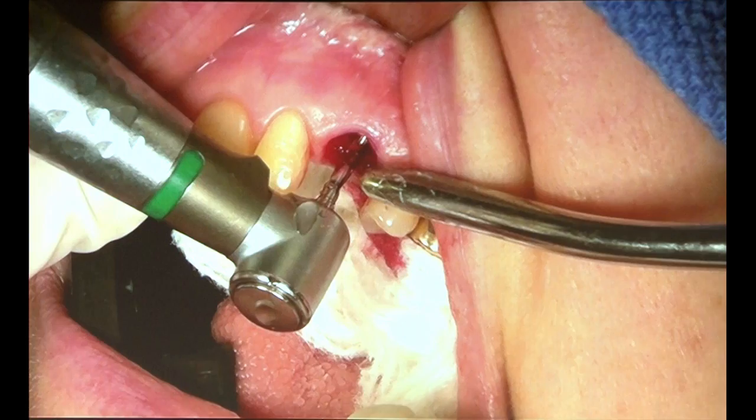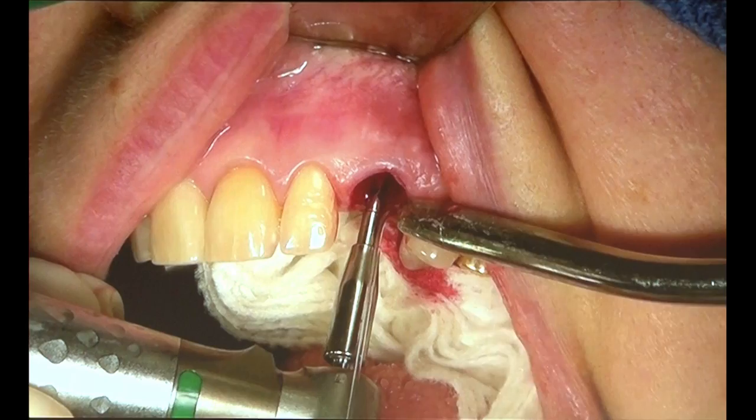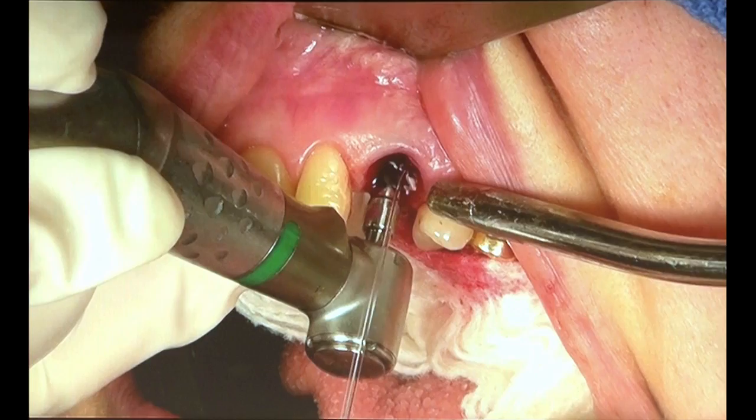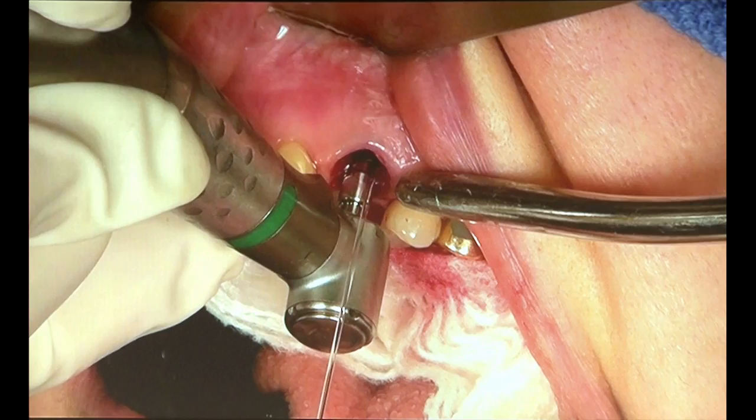For me, the goal to achieve initial stability of that implant is starting the preparation or the osteotomy along the palatal shelf or palatal vault. And as you can see, going through the preparation of the site, the second key for initial stability is creating that shoulder with your twist drills so that the implant, when it's placed, is able to be secured onto, again, that palatal shelf.